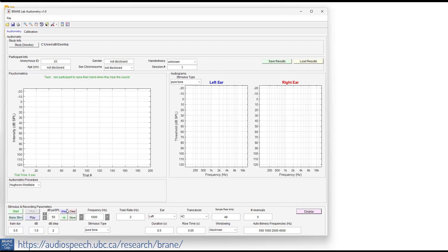And then we're going to be using these four buttons when the participant raises their hand. So the task for the participant is to ask them to raise their hand when they hear the sound. They'll be in the booth, you'll be on the other side, and you'll see them raise their hand.